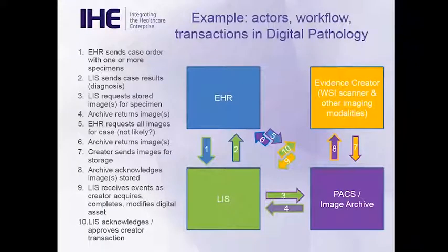And so here's just a depiction and pretty large simplification of some of the way in which our group is looking at the various actors and transactions involved in the digital pathology workflow. We started with this as kind of a proof of concept, and then recognized that there are many functions within the holistic workflow for digital pathology that might be played by different vendors in the future.